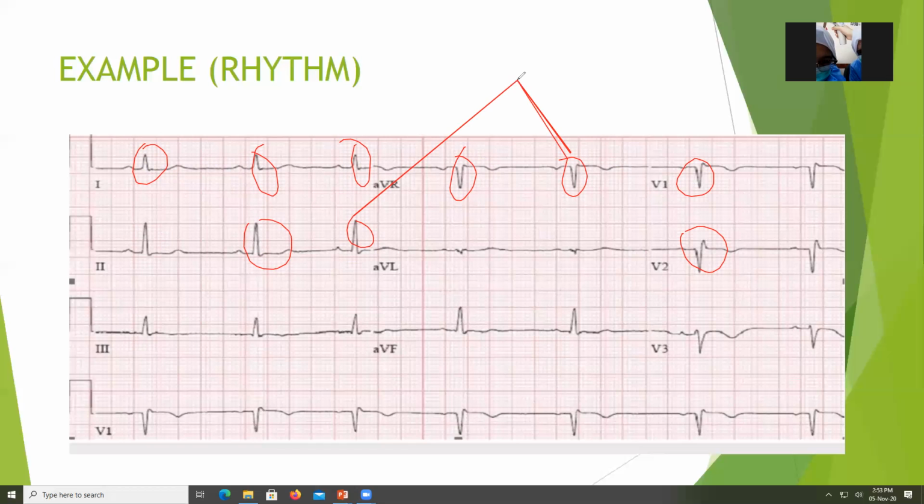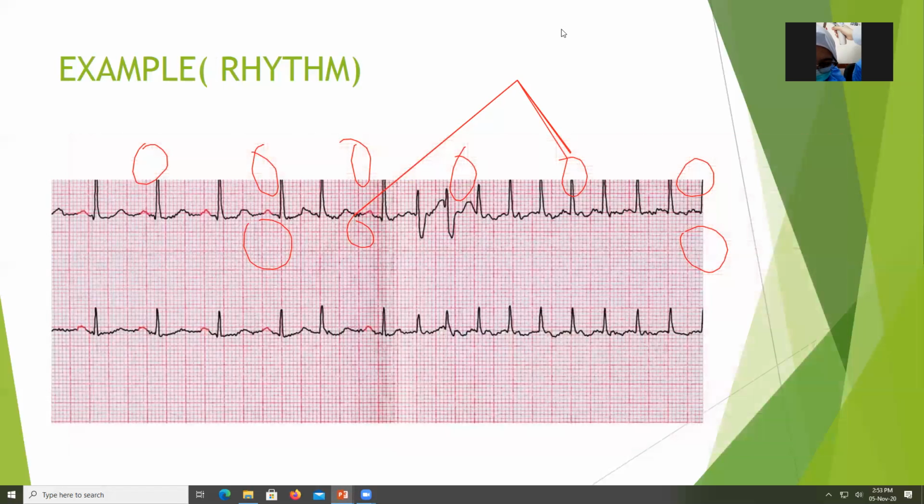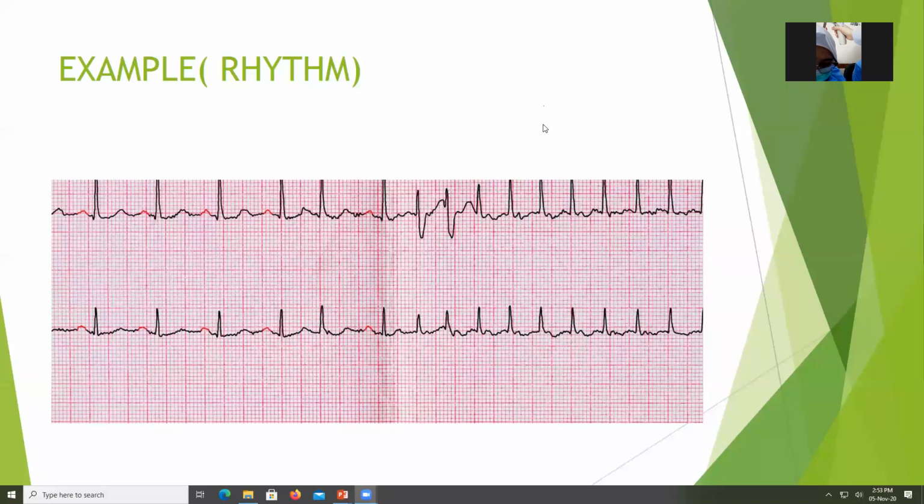So these are my QRS complex and QRS wave. The rhythm of this one is regular, meaning the distance of the QRS are all the same. So we can categorize this one as regular. Annotate, clear. So next.